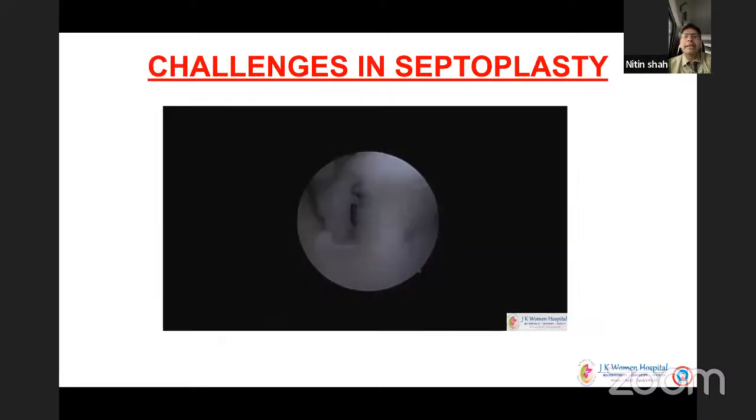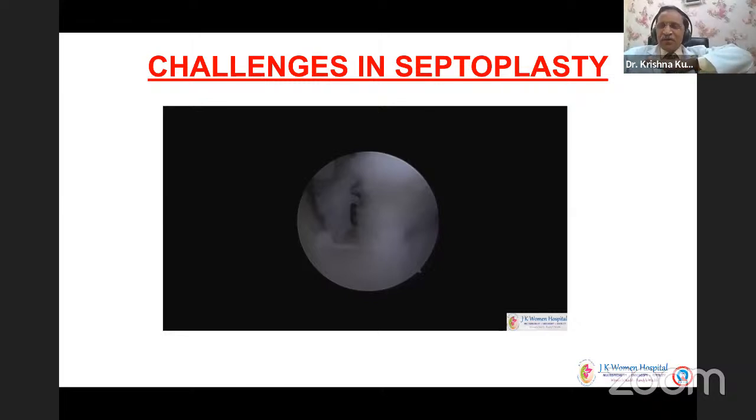Once you are planning to switch over from scissor to resectoscope, keep your outflow open. The blood will flow from your outflow. It will not clot inside the cavity. Once you change, the cut part of the septum is covered by blood. But if you keep the outflow open before removing, fresh blood will come, and that will help in irrigating faster than removing the clot.